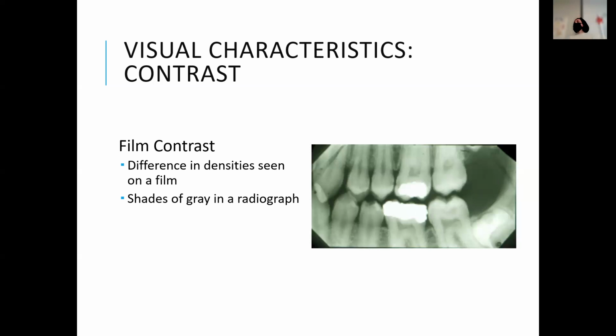So when we look at this, you guys haven't had any kind of caries interpretation yet, but when you look at this, can you see anything in this area that looks like maybe it shouldn't be there? You guys can see that. So once you train your eye to look at the dark break in the enamel, it stands out quite easily. And some areas are harder to see, but if the density is not a nice contrast, it gets really hard to see.